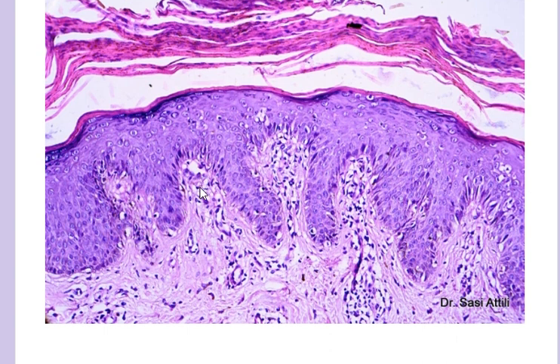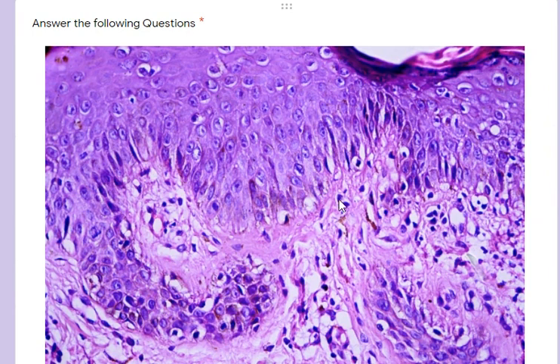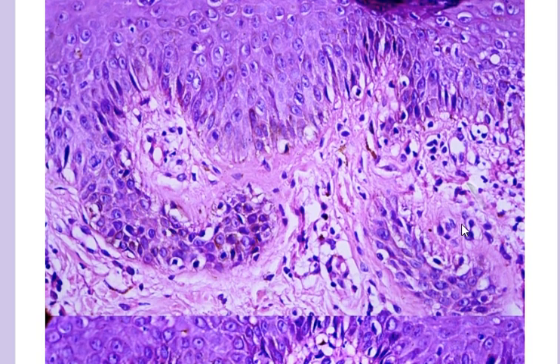with a few dilated blood vessels. But what is interesting is that there is a lichenoid, vacuolar interface change. You can see that the epidermis here, the basal layer is almost replaced by this vacuolation. You can make out some vacuolation here as well. And there are melanophages too. You can make out the melanin incontinence here.